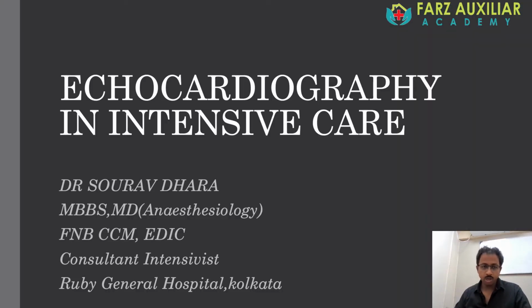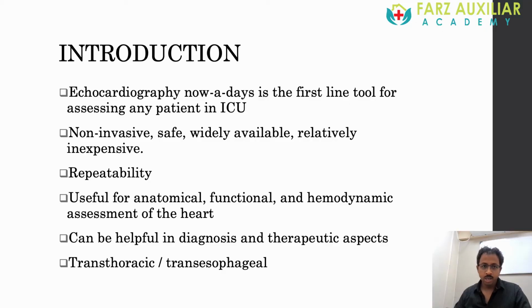Hello everyone, today I am going to discuss the role of echocardiography in the intensive care unit. Echocardiography nowadays is the first line tool for assessing any patient in ICU, as we all know. It's non-invasive, safe, widely available, relatively inexpensive, and most importantly, it's repeatable. Useful for anatomical, functional and hemodynamic assessment of the heart. It can be helpful in diagnosis as well as in therapeutic aspects.